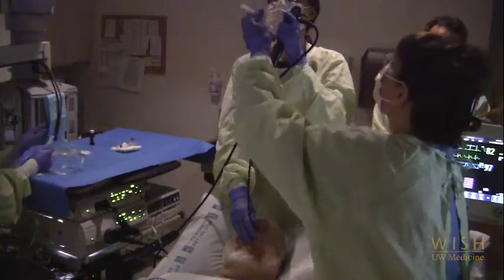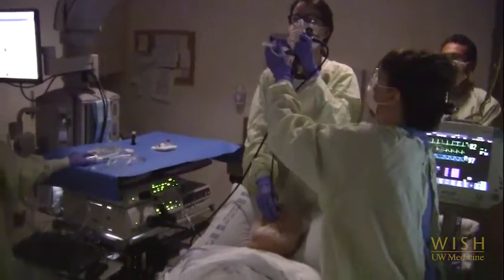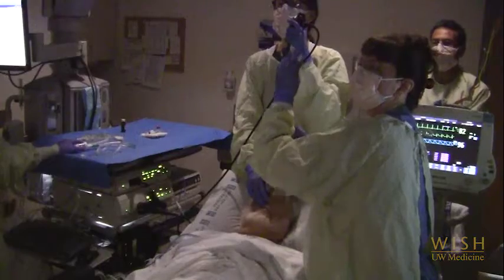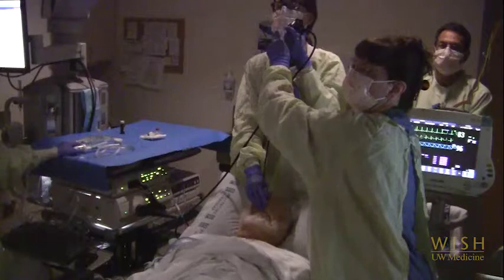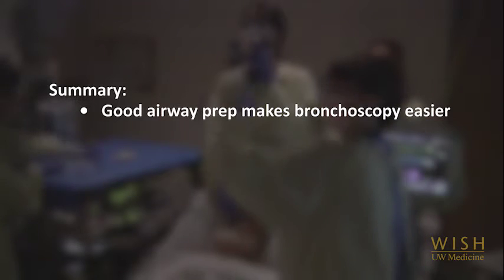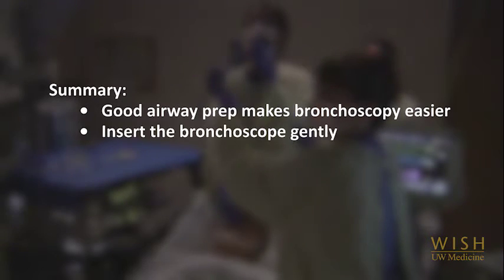Additional lidocaine is applied to the vocal cords through the working channel of the bronchoscope prior to inserting the bronchoscope through the folds. Most providers try to get at least two or three doses on the cords before passing through. The bronchoscopist should hold the bronchoscope as straight as possible. To summarise, good upper airway anesthesia can be achieved by a variety of methods and takes patience, but will result in an easier bronchoscopy by reducing gag and cough. When passing the bronchoscope through the upper airway, be gentle, and if vision is poor, follow the black.